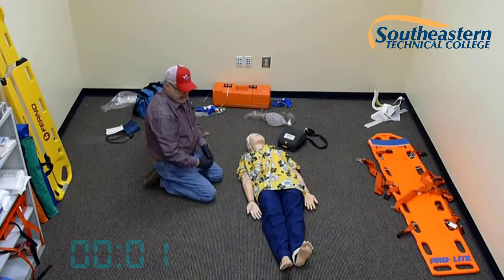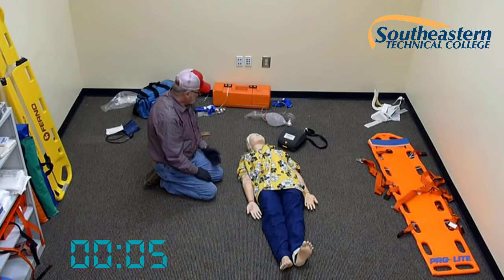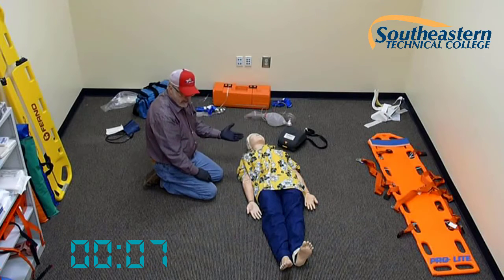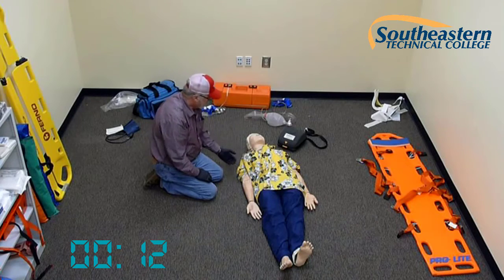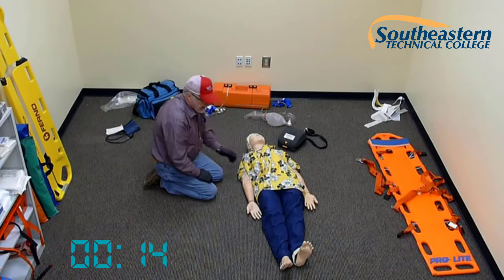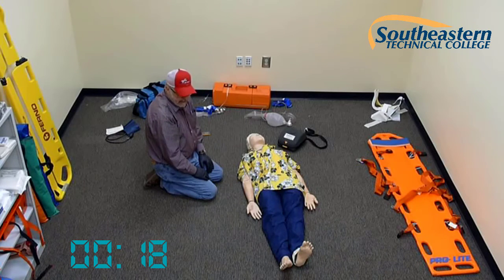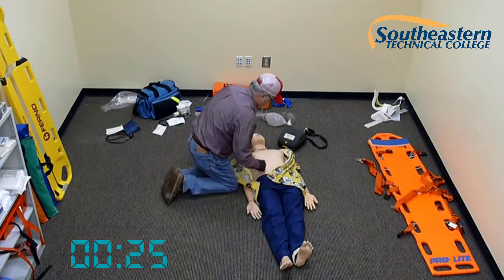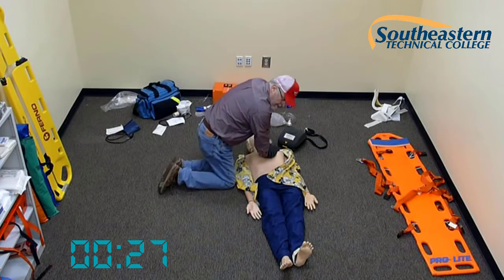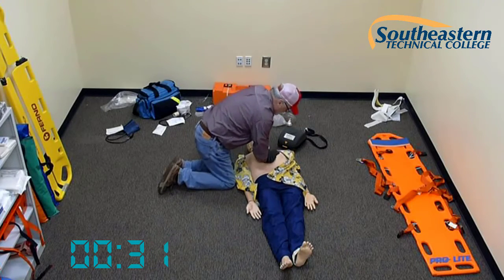So as you approach your patient, of course, making sure the scene's safe and we have our gloves on, we will assess, hey, are you okay? We're looking for any signs of life, chest rise, breathing, or anything like that. Hey, are you okay? At this time, the evaluator will tell you that your patient is unresponsive, is apneic, and pulseless. So we would immediately expose the patient's chest and begin CPR. Somebody call 911 and get me an AED.